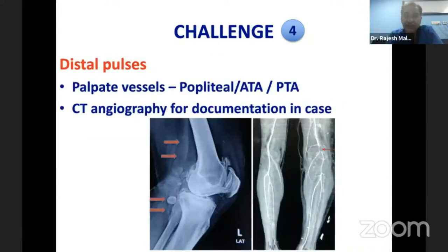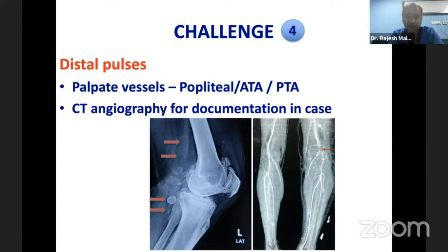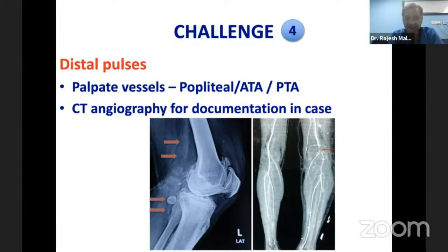The fourth challenge is to palpate the vessels. While important in all TKA, it is particularly important in post-traumatic cases. Palpate the popliteal, anterior tibial, and posterior tibial vessels. If you have any difficulty palpating the vessels and suspect a problem, CT angiography must be done to document findings.